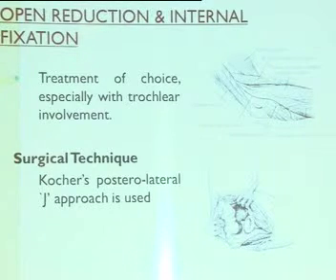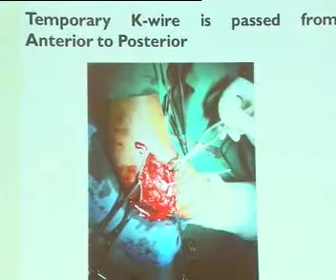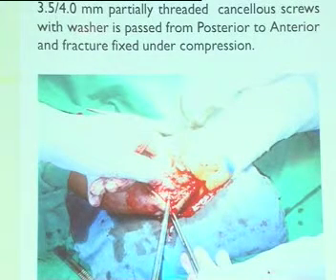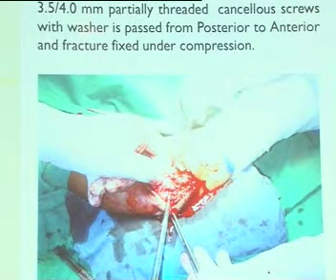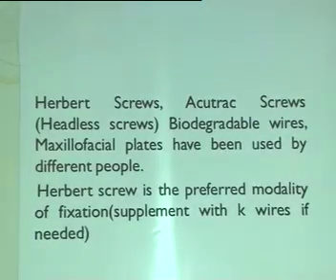The surgical technique is simple. You use the Kocher's posterolateral J approach. This is the exposure. You reduce the fragment and fix it temporarily with a K-wire. A 3.5 or 4 mm partially threaded cancellous screw with washer is passed from the posterior to the anterior and the fracture fixed under compression. Herbert screws, Acutrak screws, headless screws, biodegradable wires, maxillofacial plates have been used by different people. Herbert screw is the preferred modality of fixation. It can be supplemented with K-wires if needed.